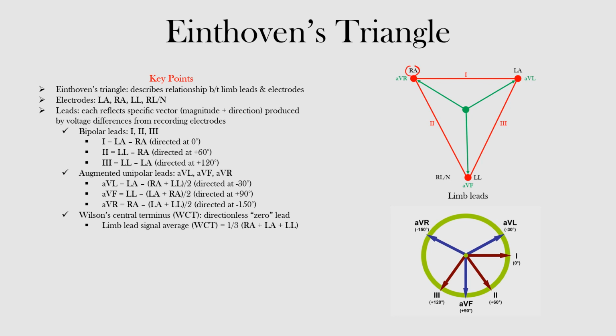Here's our right arm, okay? Imagine this is the patient here, and we're looking, this is the right side. This is the left side. This is the left arm here. This is the left leg, so the left leg here. And this is our right leg or neutral electrode.